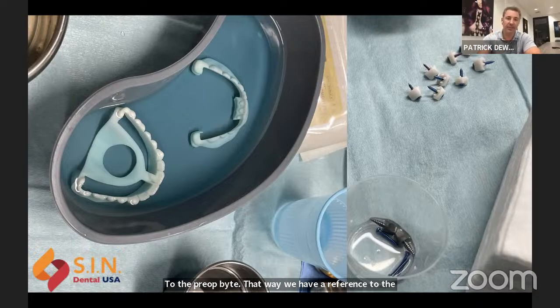Now, on the left, you'll notice that we've printed what we refer to as MUA guides, so multi-unit guides. This is going to ensure, after implant and multi-unit abutment placement, that we can verify there are no facial access holes coming out because of the way the implant or the multi-units are positioned in the mouth. So at this point, we'll check these using these guides before we torque down our abutments, and you'll see this here in just a few slides.